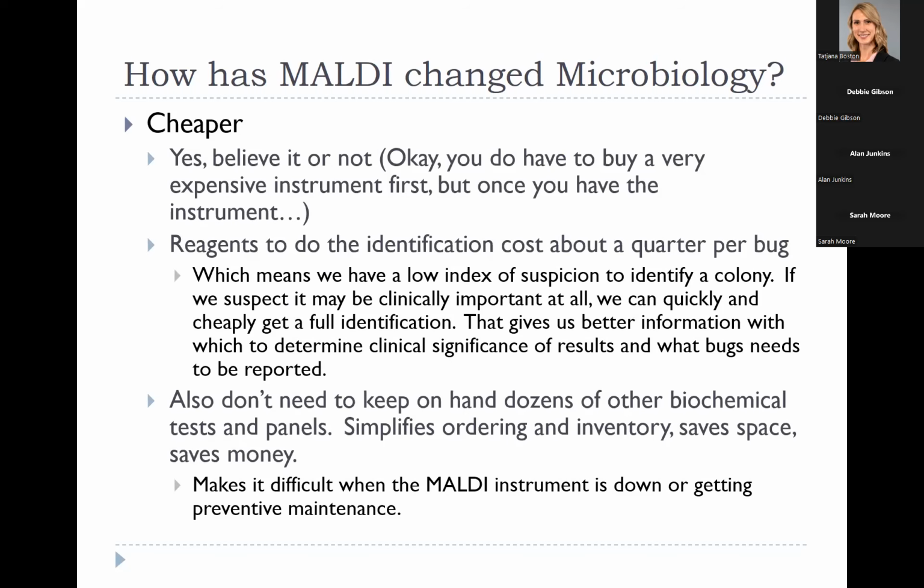Actinotignum schaalii is very common. And some of the stuff that's in the literature about them, this one here is really cool, the Pseudoxanthomonas kaohsiungensis. The only paper out there is that it was isolated from an oil-polluted site in Taiwan. We've gotten it twice from patients. It's kind of hard to figure out the clinical significance.